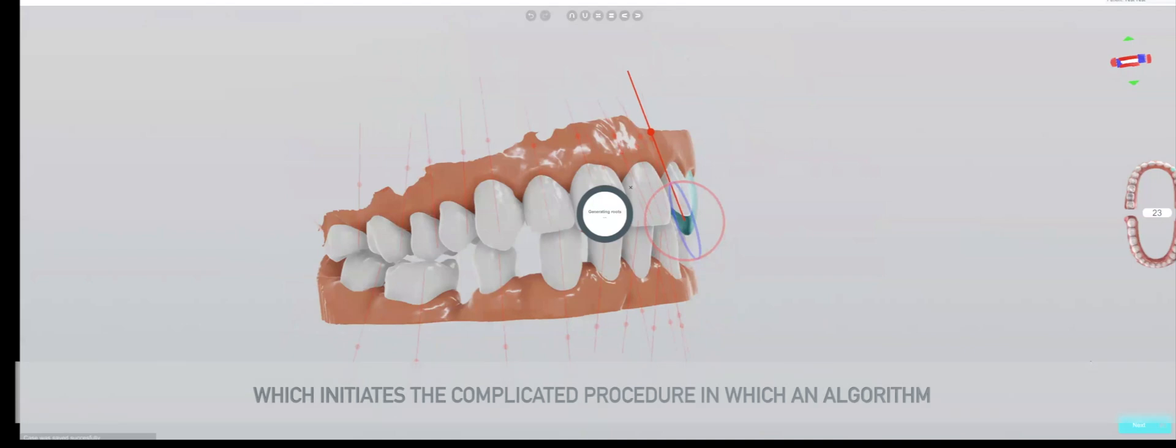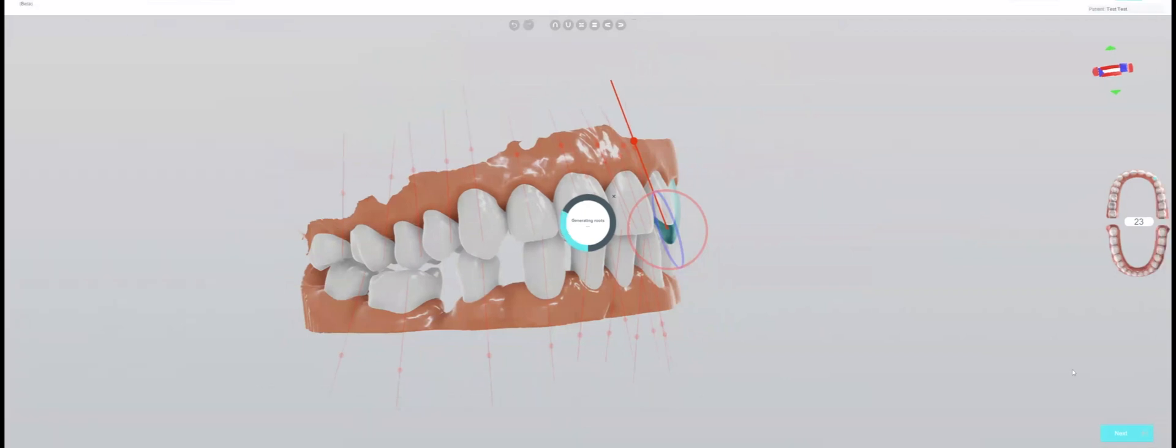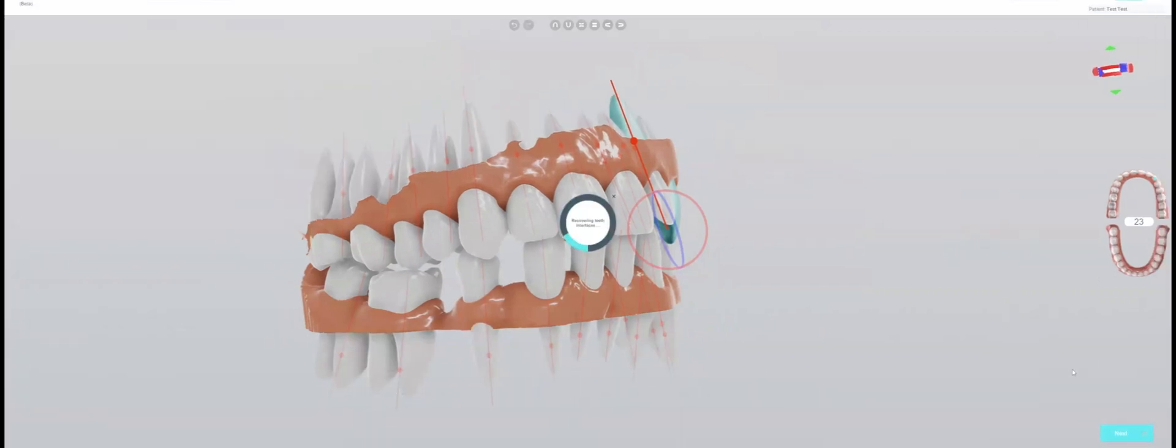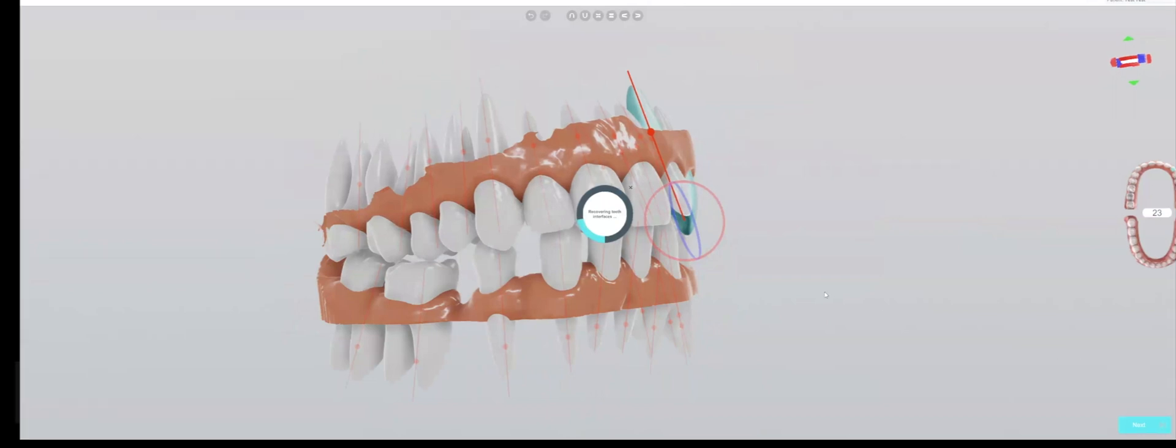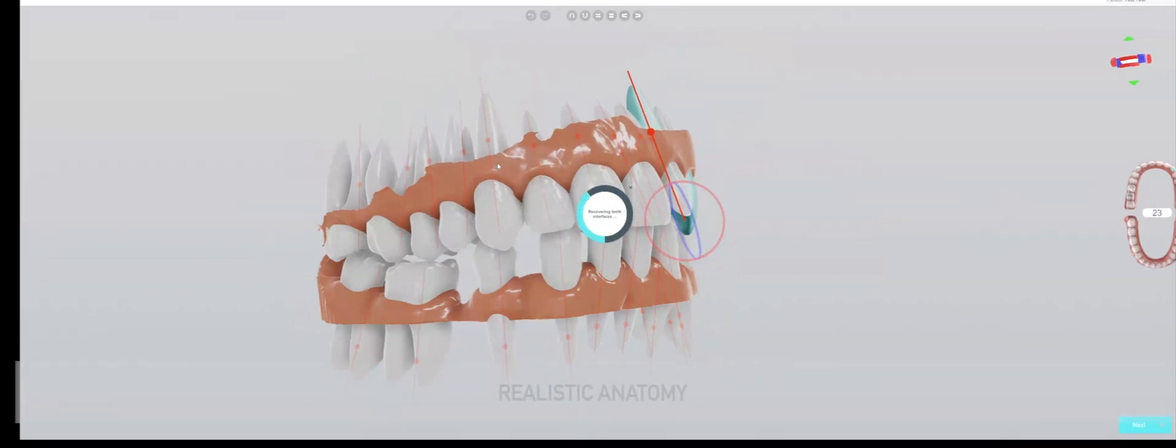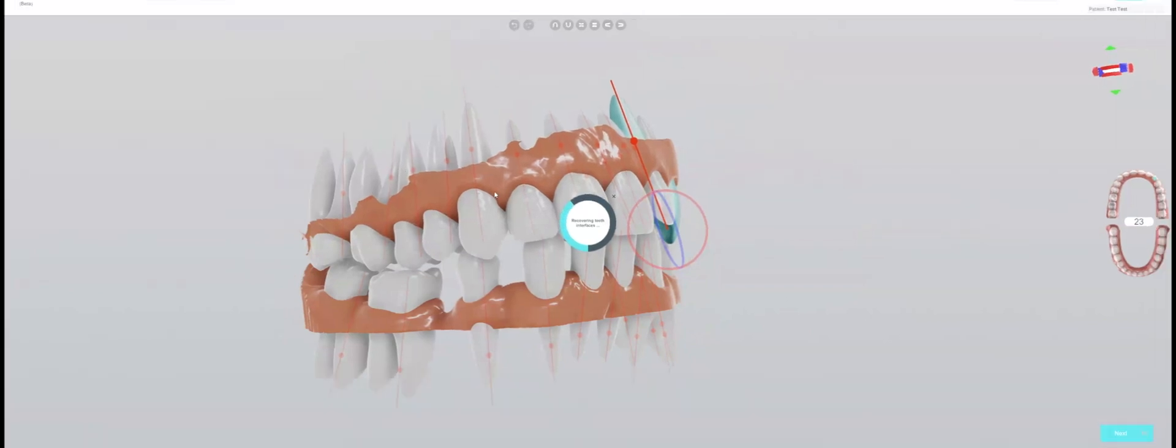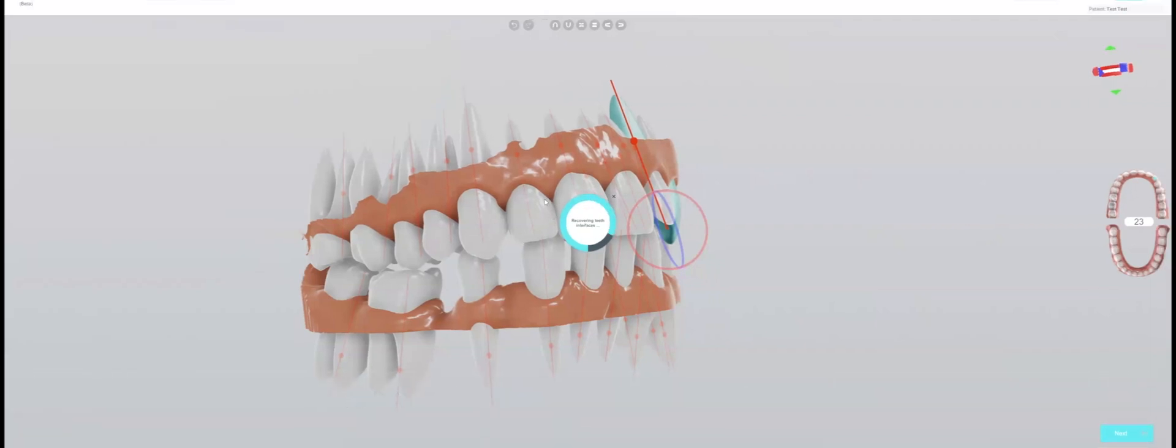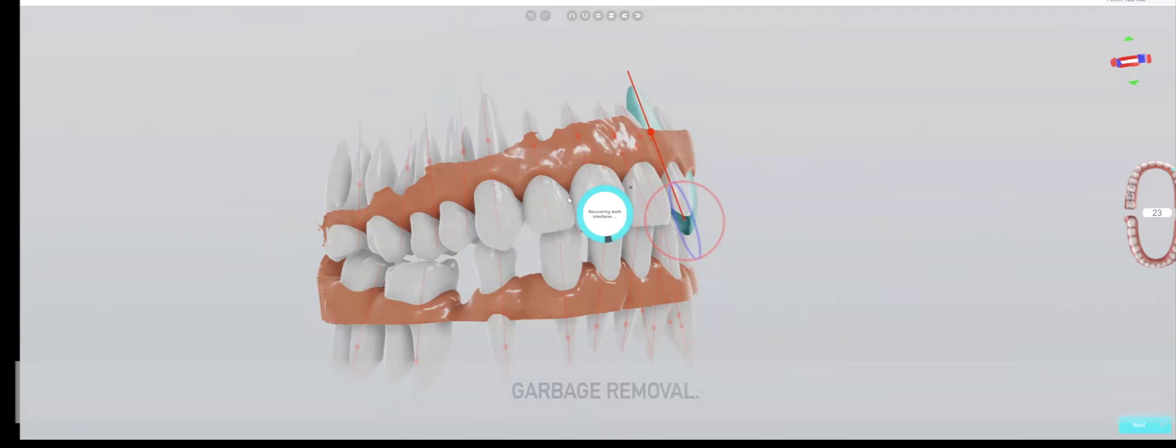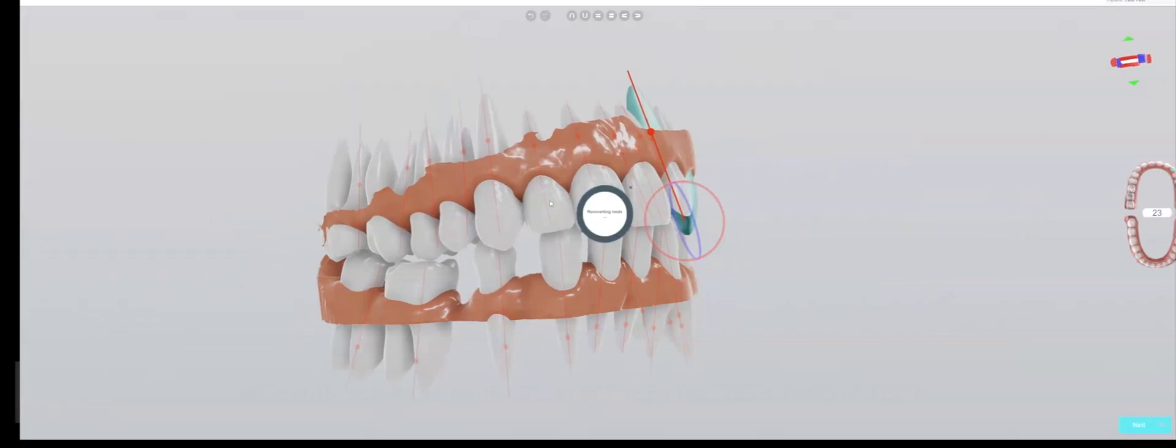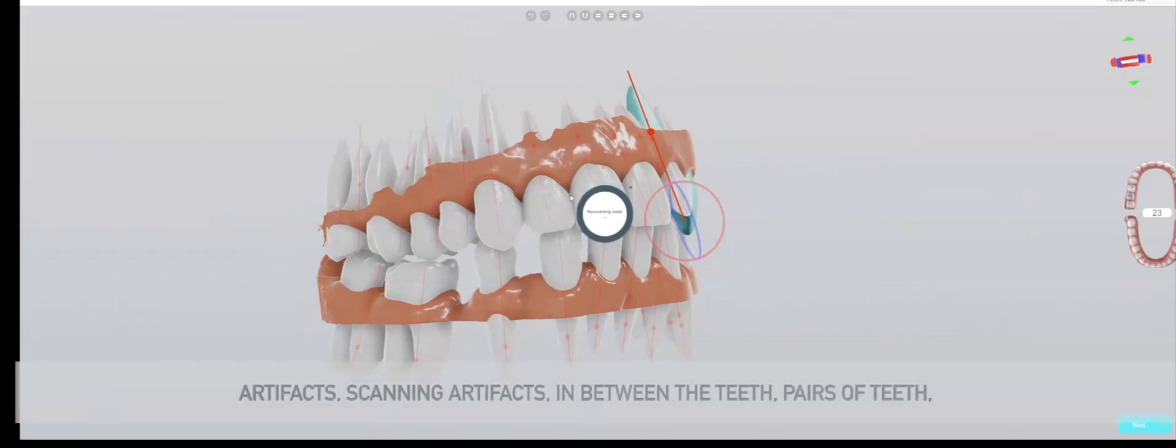This initiates a complicated procedure in which an algorithm is first of all generating artificial roots, each of which have realistic anatomy, and also performs something called garbage removal.